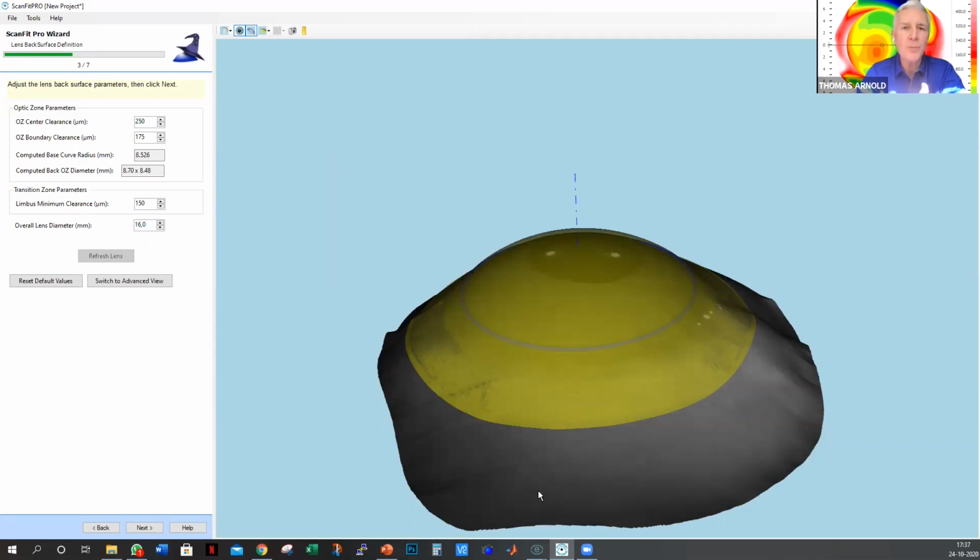And that way, you're not putting multiple diagnostic Scleral lenses on a patient, which means you have to fill up with salines, you got to put the fluorescein on, you have all that. The first lens you order empirically from these data is going to be right on. And the only thing that you might end up tweaking is that final refractive power, but you're going to be close enough where I'm going to say 95% of the cases, that first lens that you've ordered empirically from these data, they're going to be able to walk out with. So it really is a time saver.